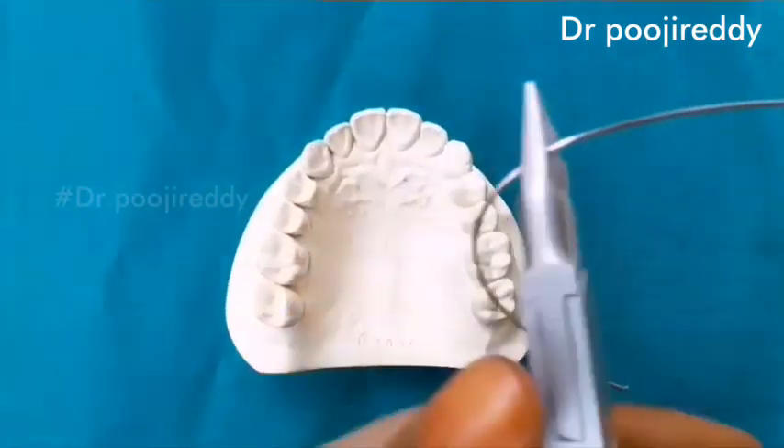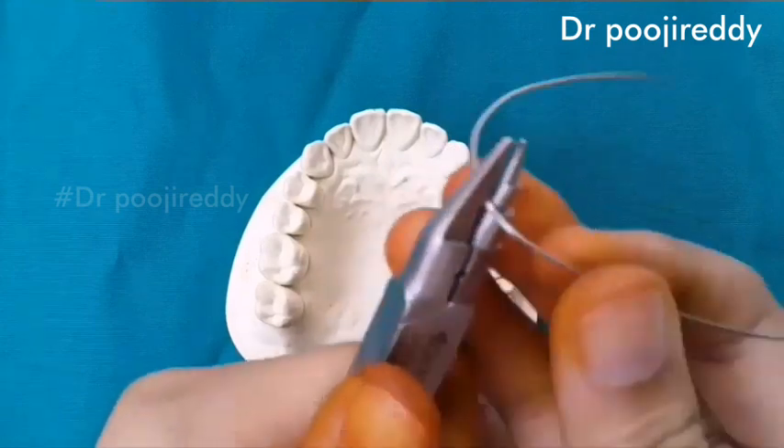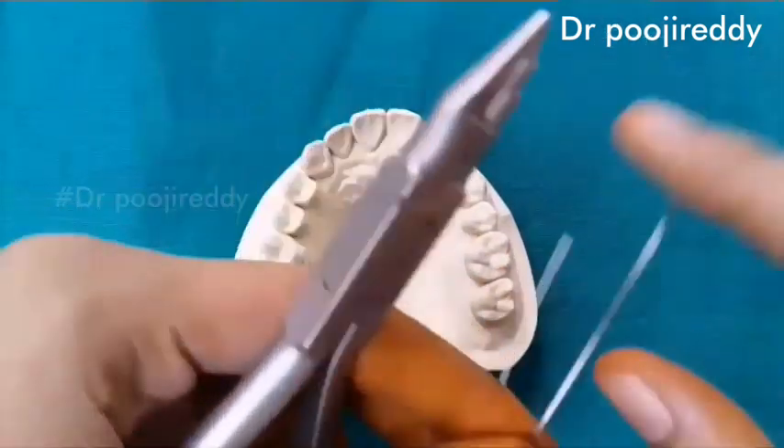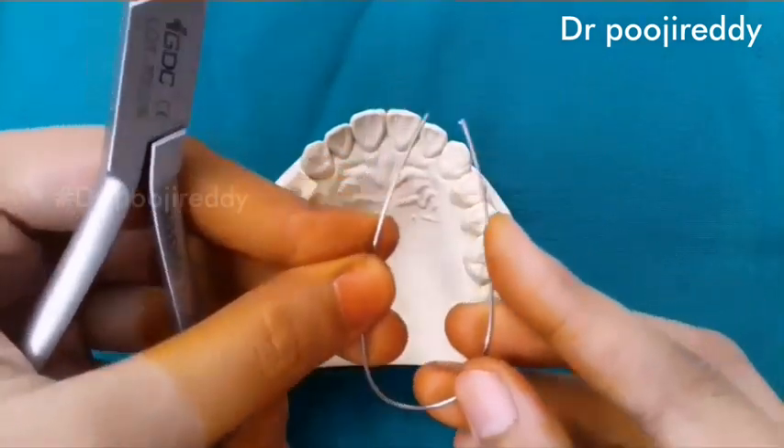First of all, bend the wire so that it will come into a U-shape. So this is the U-shape we have done.